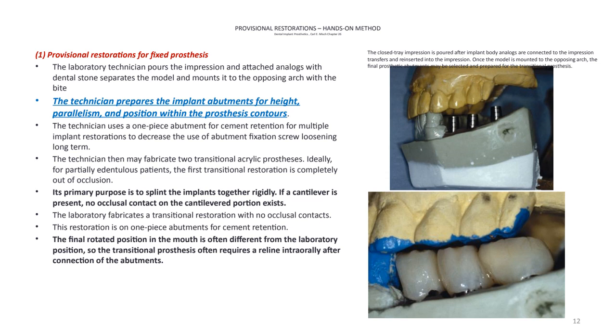So sometimes we may need, like we said, to trim those temporary abutments, not only to cut them from the length to have enough occlusal clearance, but also mesial or distal, lingual or buccal, to have them fit and be parallel with each other.